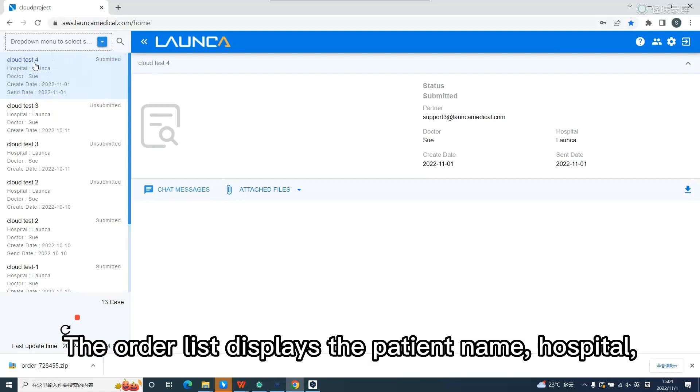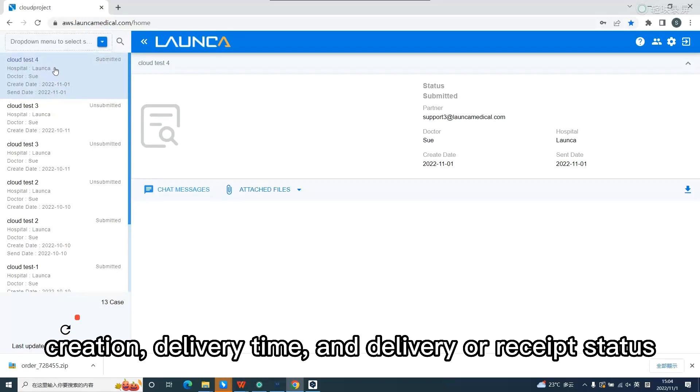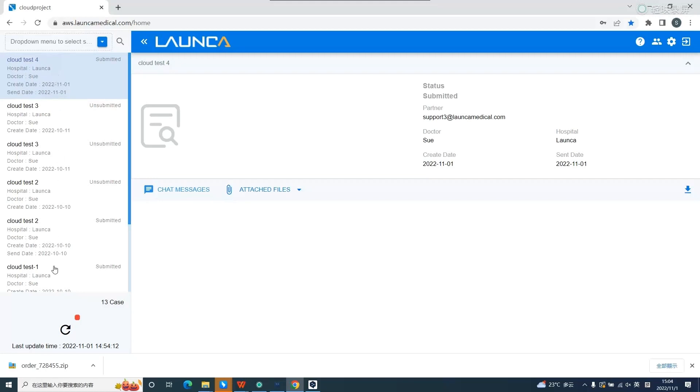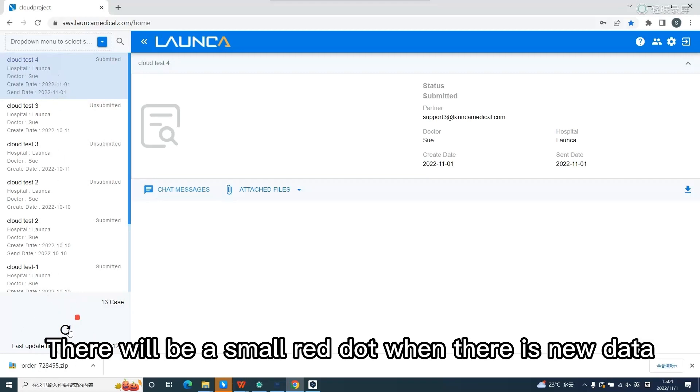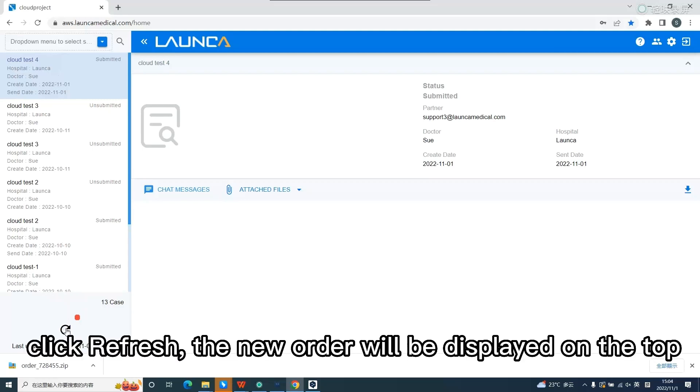The order list displays the patient name, hospital, creation and delivery time, and delivery or receipt status. The bottom is refresh. There will be a small red when there is new data. Click refresh, the new order will be displayed on the top.